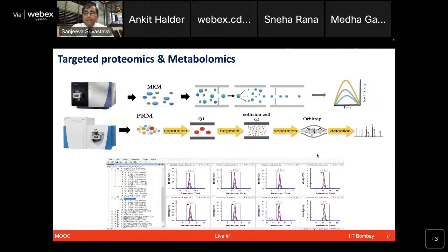So now you can use different approaches for doing validation. While many antibody-based approaches are powerful, especially if you want to use a mass spectrometry-based approach, triple quadrupole-based mass spectrometers are a very powerful way of validating your findings at the targeted level. So what we are now looking at is targeted validation, a specific target which you want to validate, right?